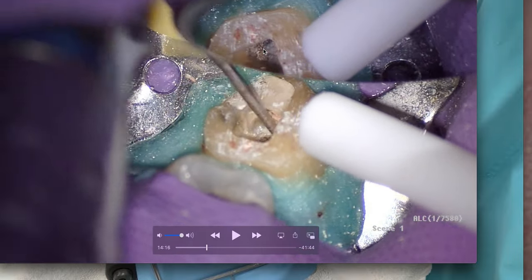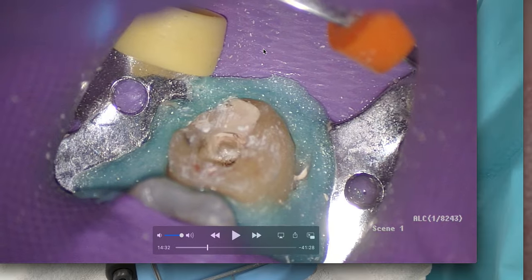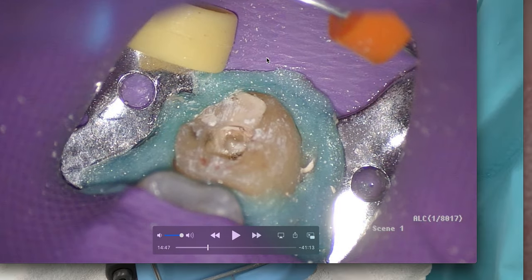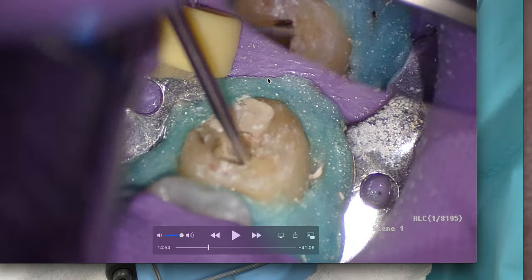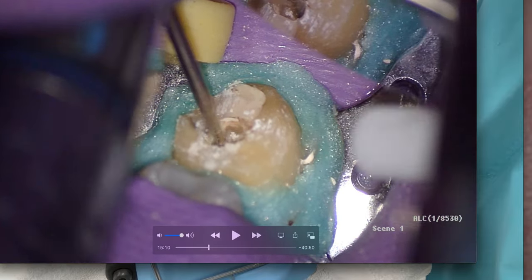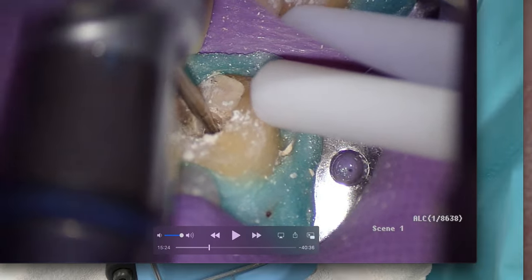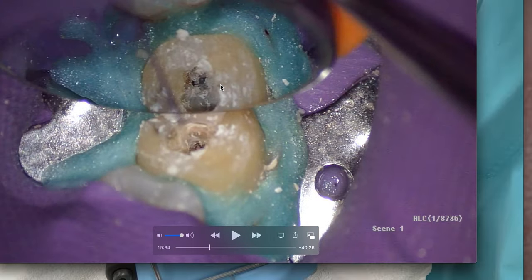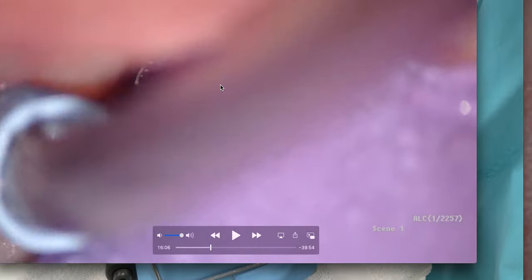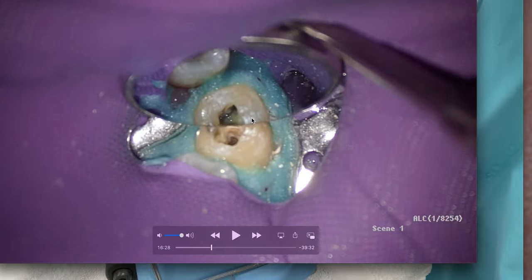It's really important to remove all this pulp tissue and not assume your irrigant will break it down in the pulp chamber. That's been my experience — I go to finish a case and there's still pulp tissue hiding there. I'm taking the MonoSpur and literally troughing between the two mesial canals. Using the ultrasonic handpiece is really effective for this. I don't routinely use ultrasonic for standard endo — I use it for retreatments — but for troughing and removing residual pulp tissue it's very effective.